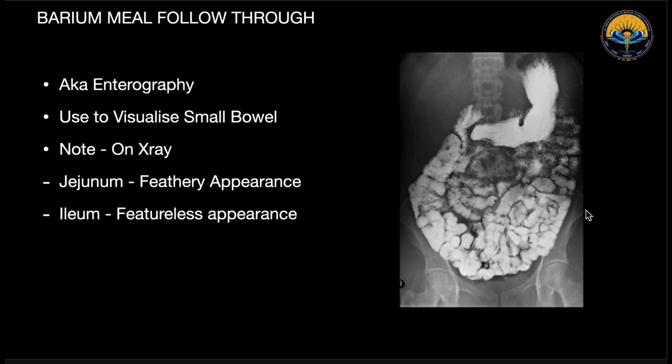Coming to the next, barium meal follow through. Barium meal follow through is also known as enterography and is used to visualize small bowel up to the ileocecal junction. And we should also note that on X-ray, jejunum will have a feathery appearance, whereas ileum will be featureless.